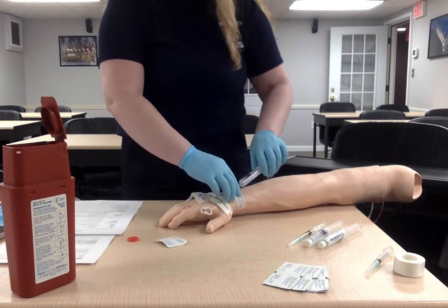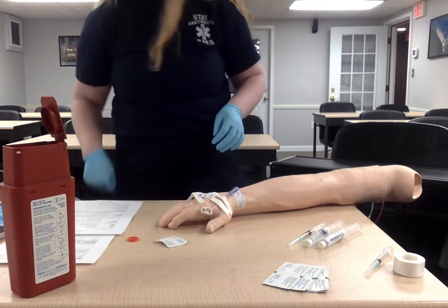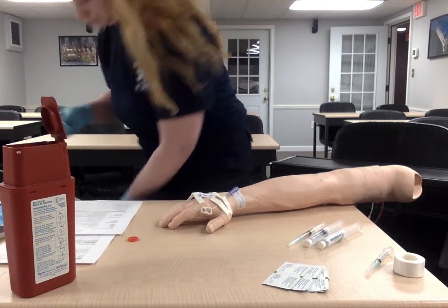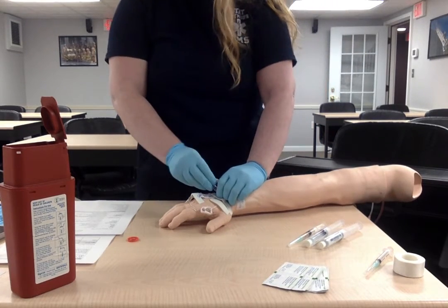So at this point, we've made sure that the line's patent, no swelling, no redness. We're going to discontinue this. We can throw that flush out. And now we're going to take another alcohol prep pad, and again, clean like we did before for roughly a minute, just to make sure that everything's sanitized the way it needs to be.